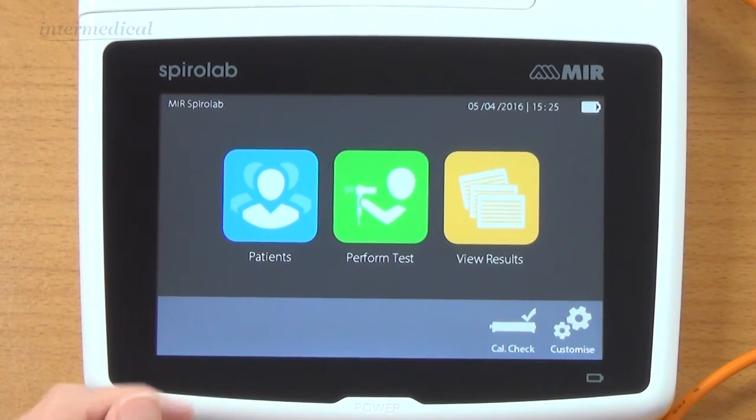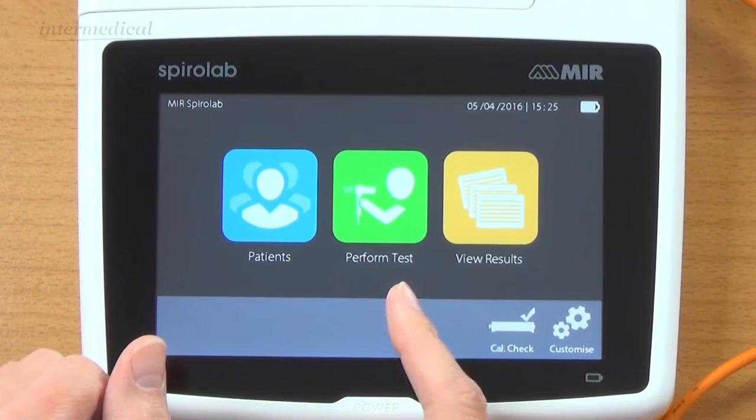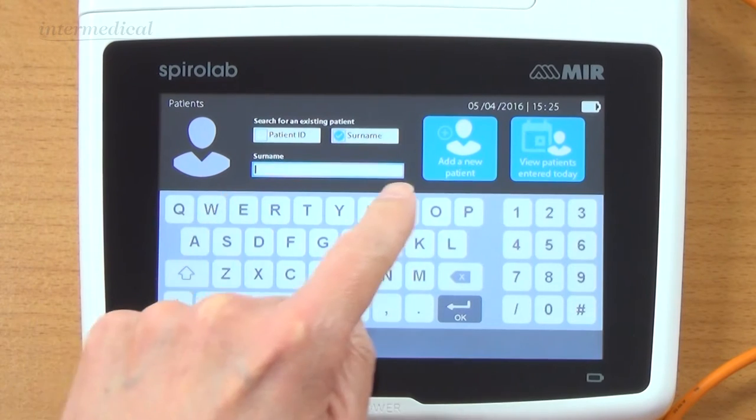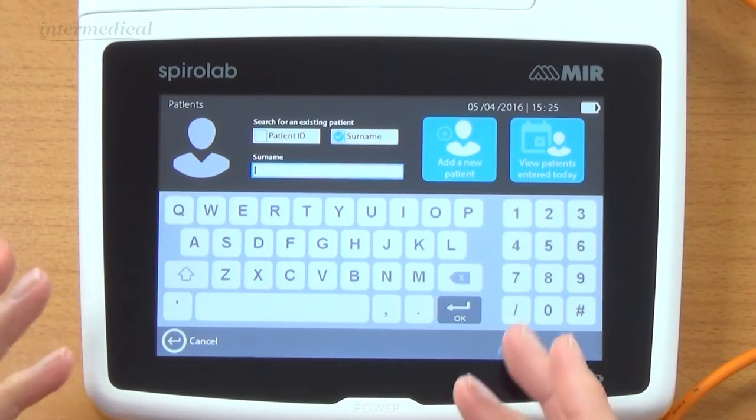You get three icons on the screen: patients, perform a test, and view results. If I click on patients, it allows us to put a surname or an ID name in to search for a patient.